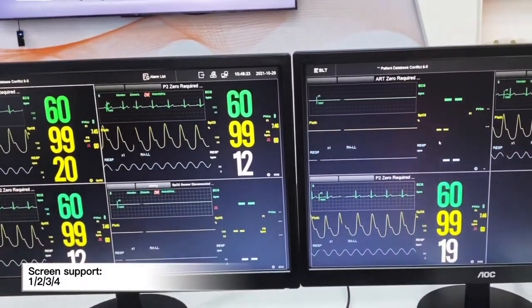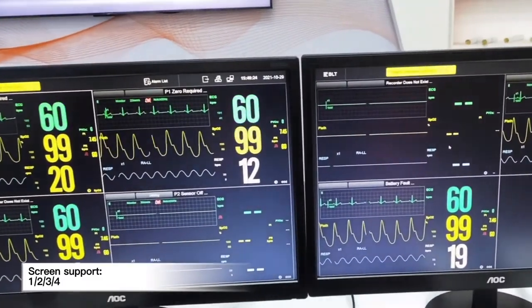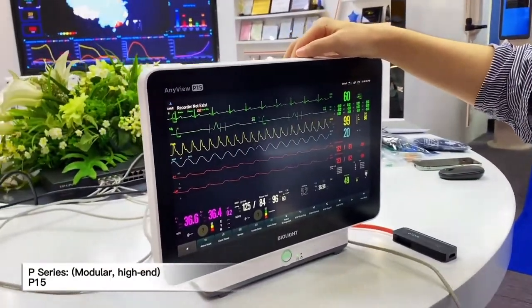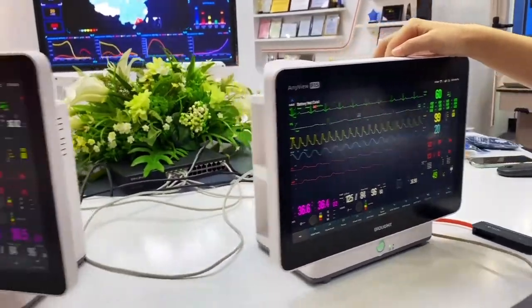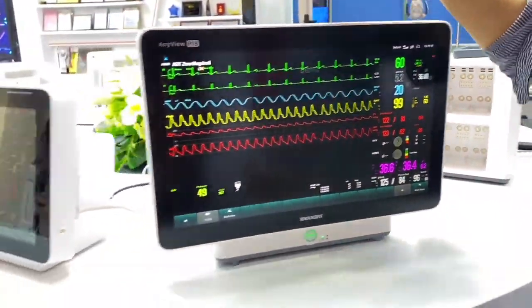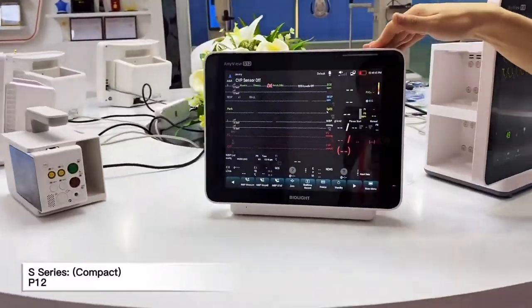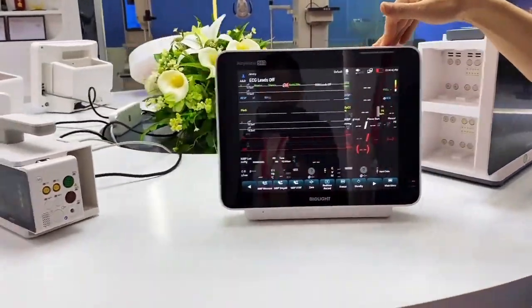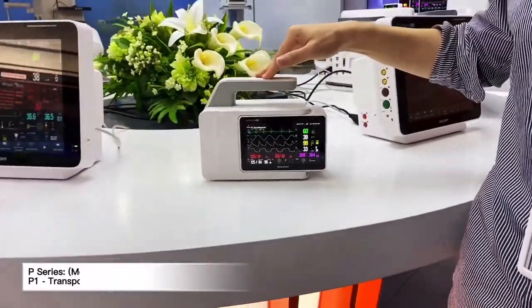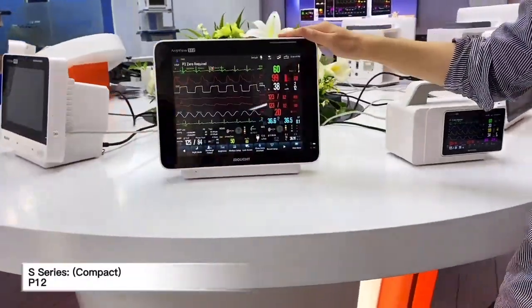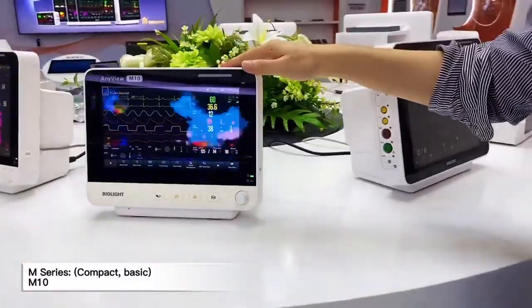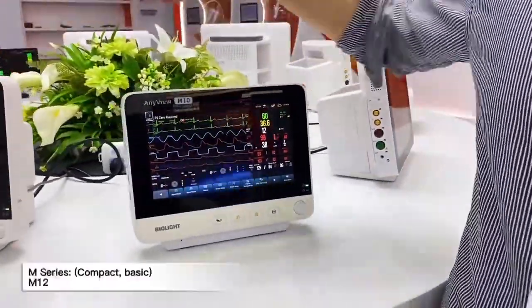The number of screens depends on the screen size and how many patients we need to put into the system. We have our P-15, which is the brand new P-series patient monitor, and also our P-18 and S-series patient monitor, including our P-1 transport monitor, and also M-series M-10 and M-12.